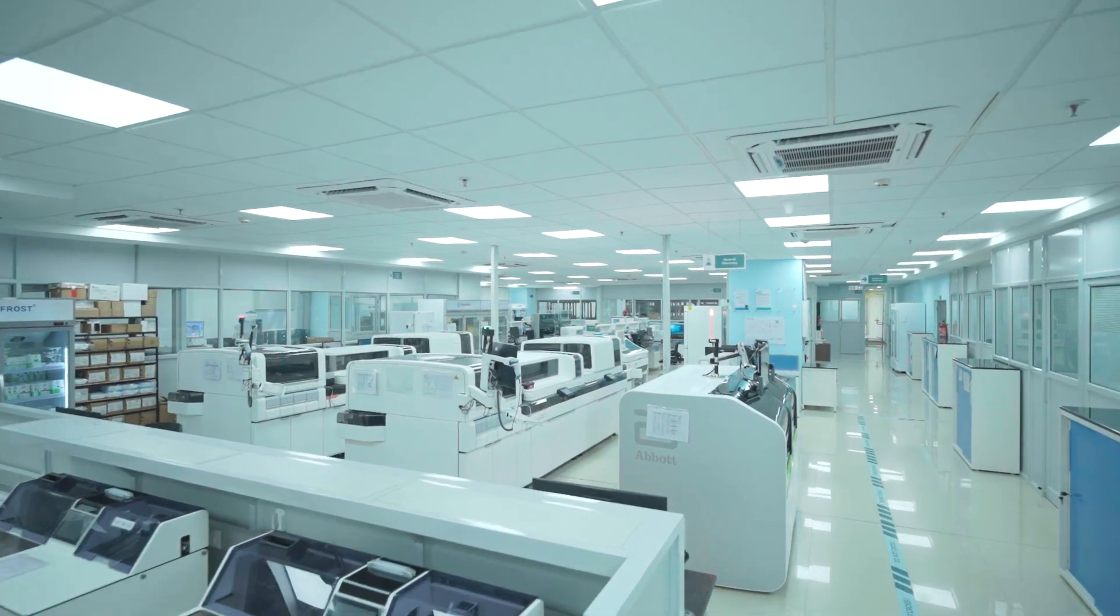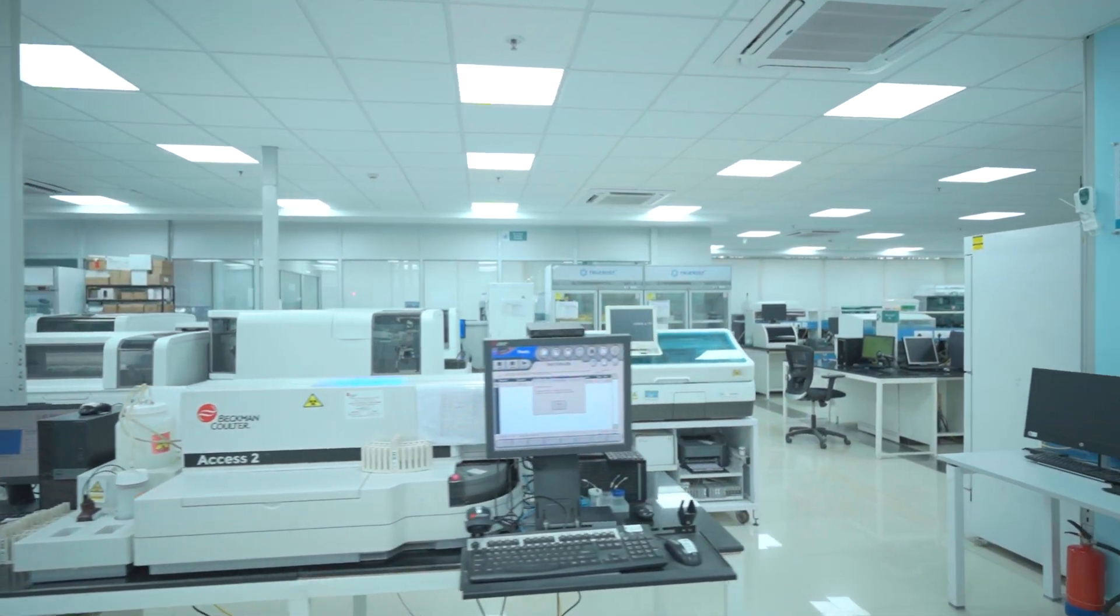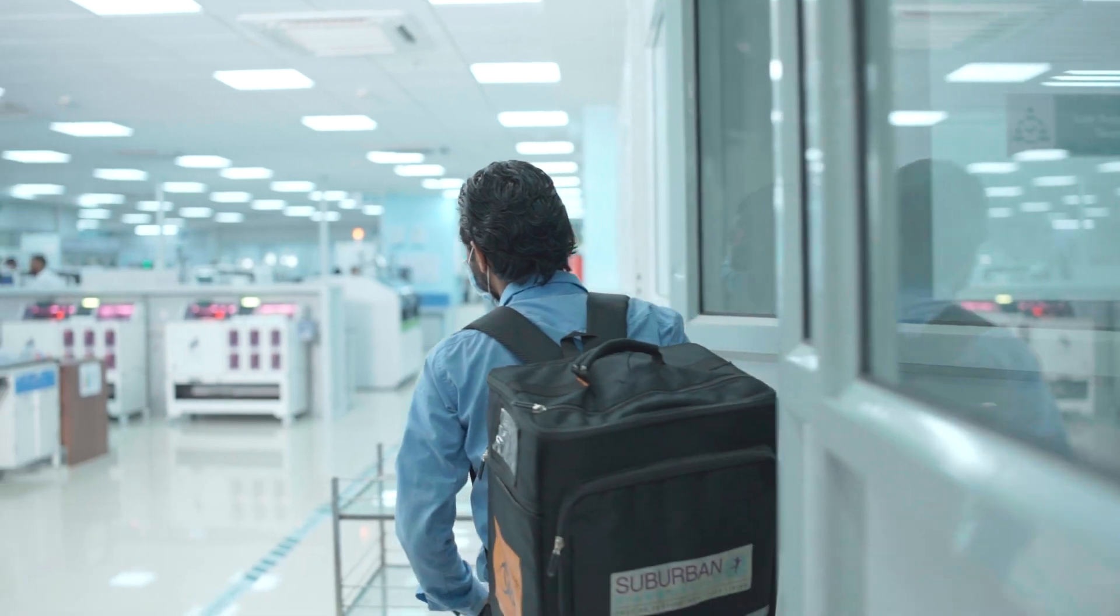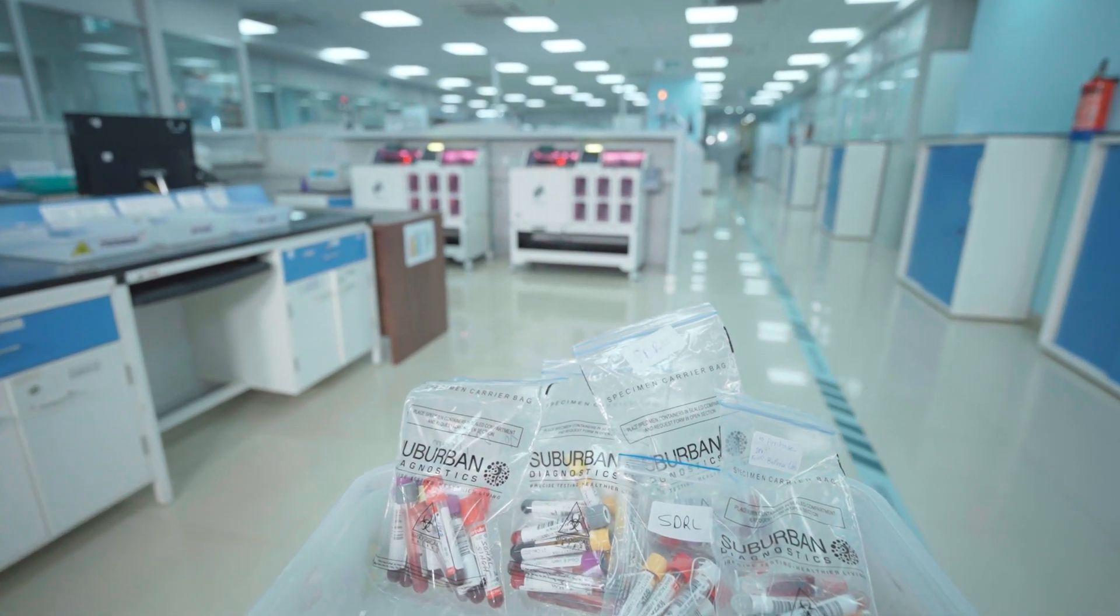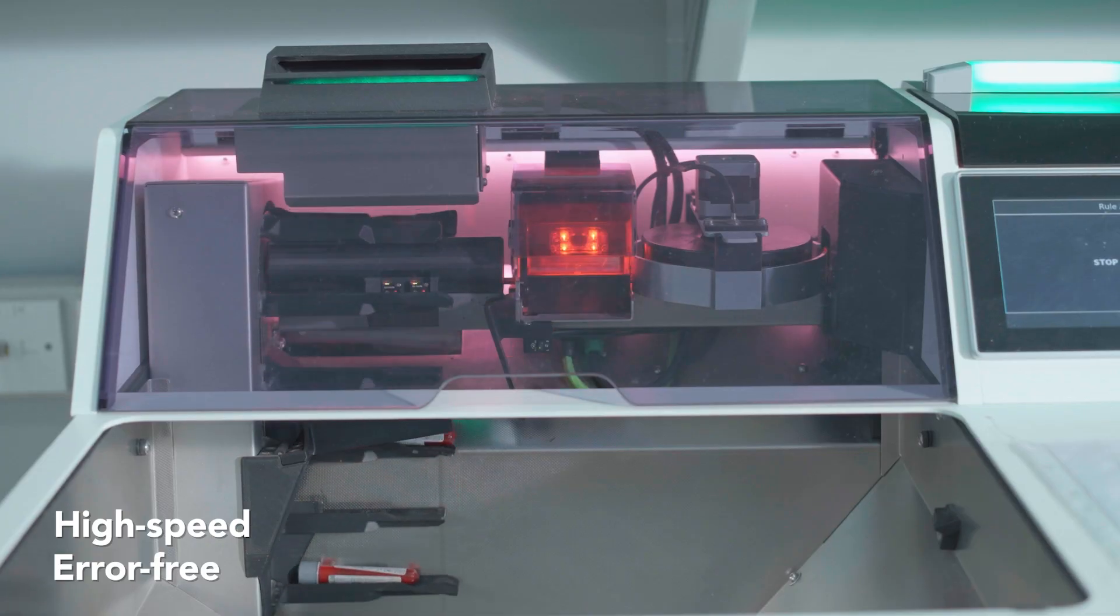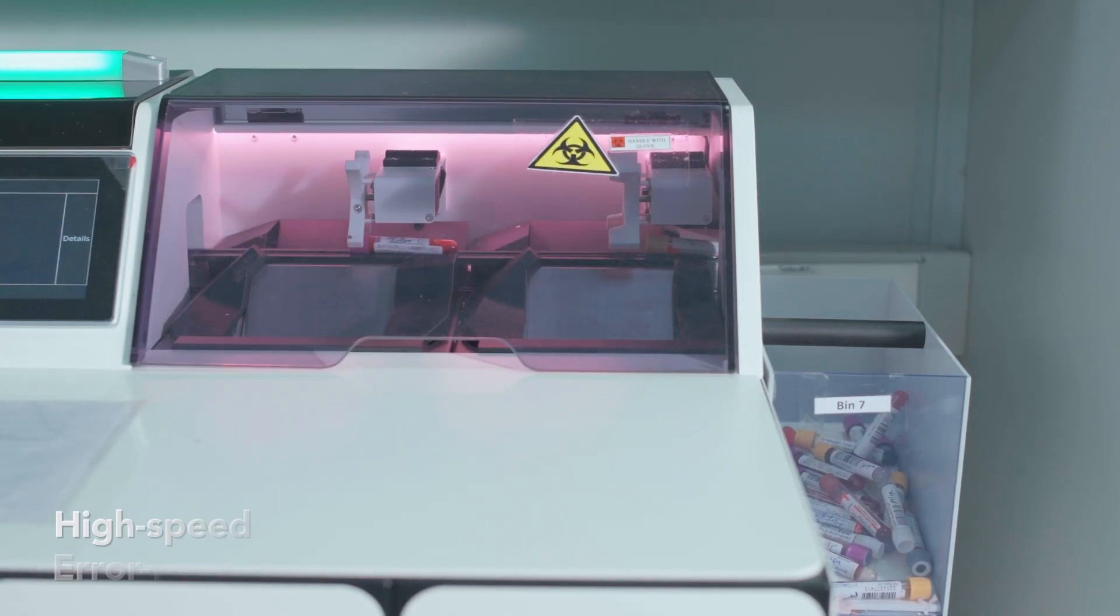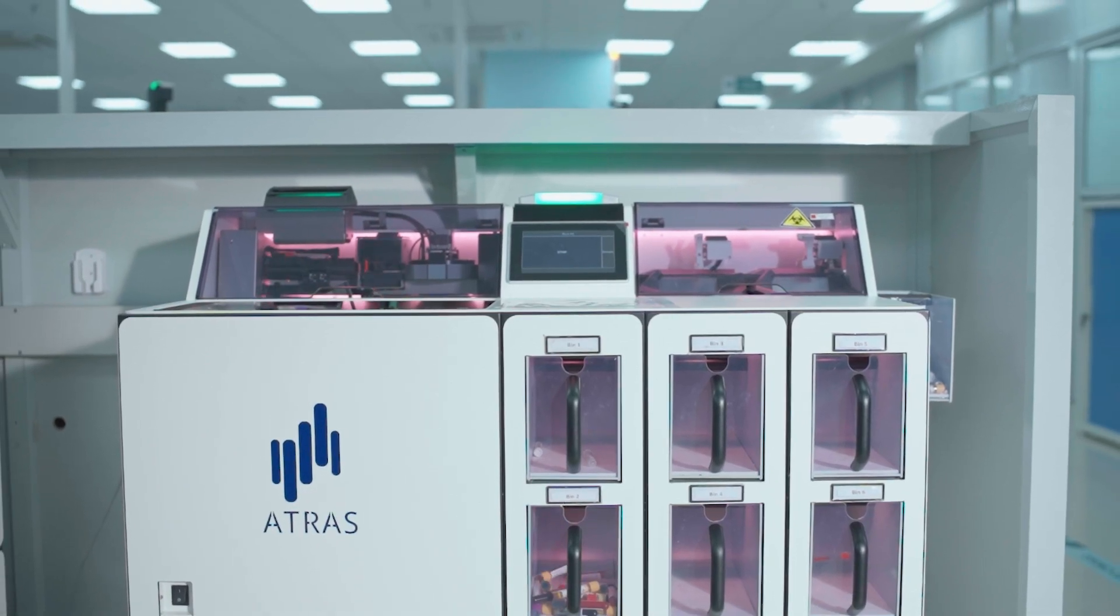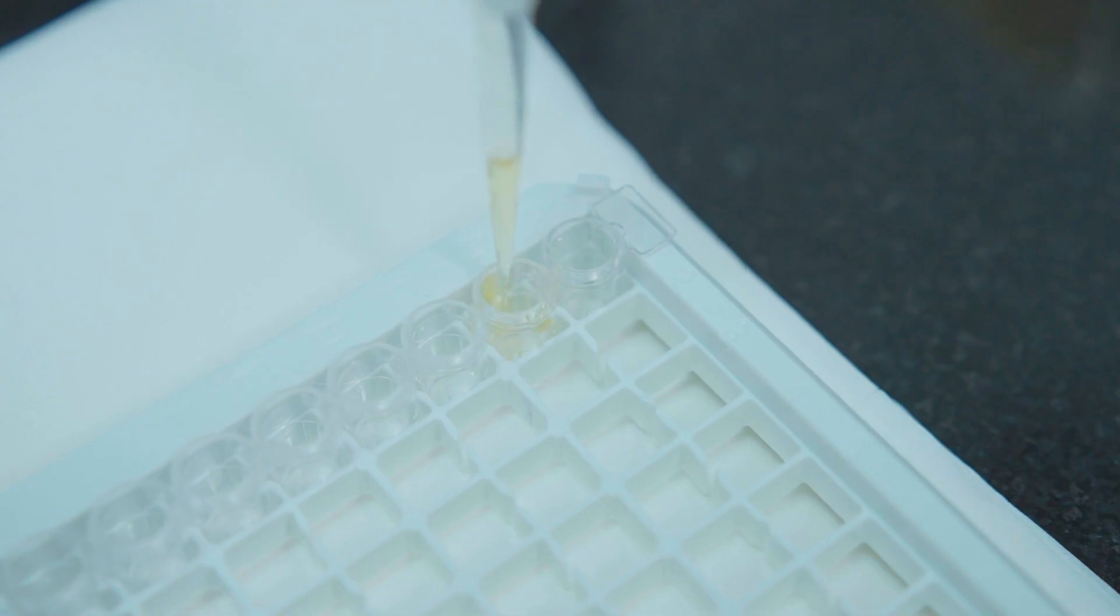All samples at SDRL go through numerous automated quality checks. We are now equipped with automated tube sorters that ensure high-speed, error-free, barcode-based, department and test-wise sorting of blood tubes. Let's take a closer look into SDRL's testing capabilities.